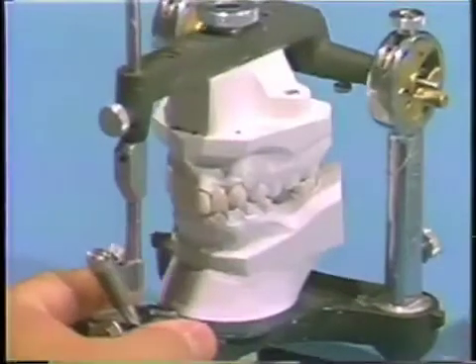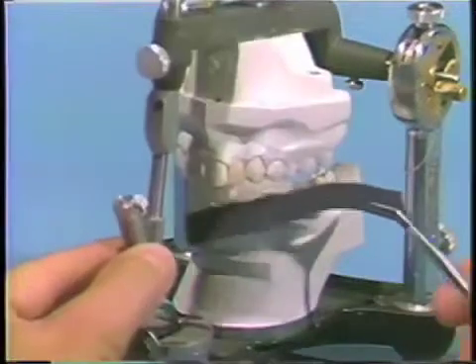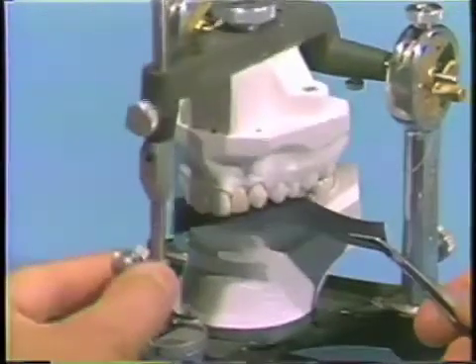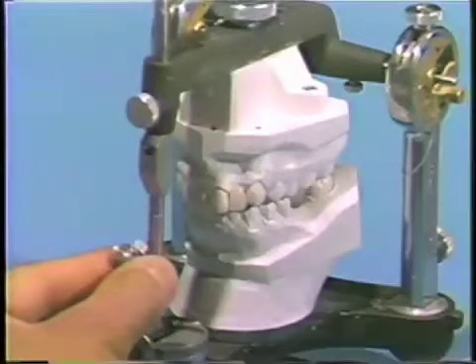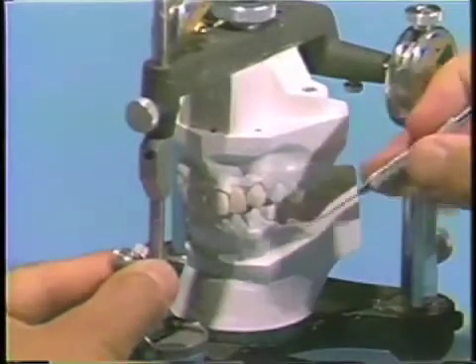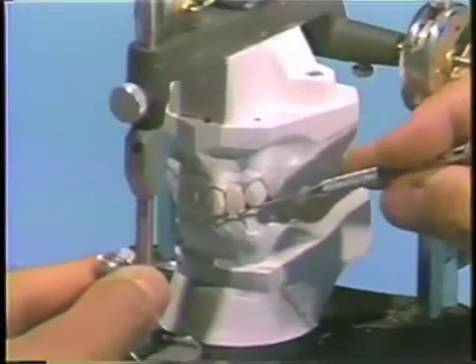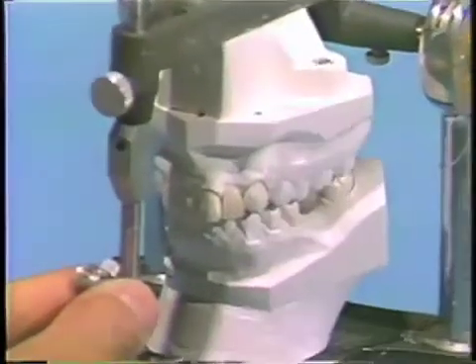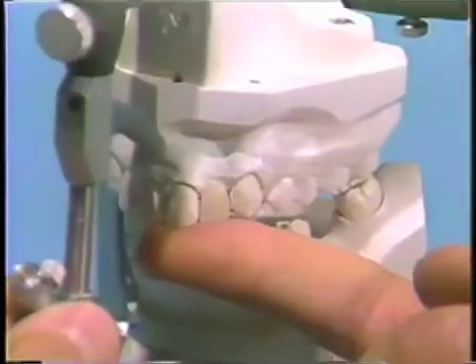After this check has been completed, the bridge is cleaned and is finally checked in with your instructor by checking the occlusion. The excess cement is removed, the margins are double checked, and then the bridge is placed in a bag with the rest of the preclinical materials and turned in to the preclinical office for final evaluation.